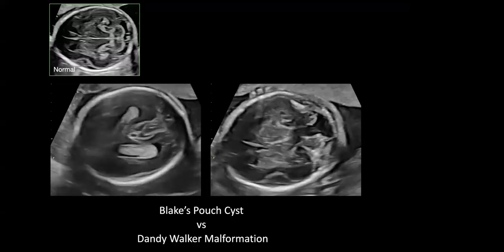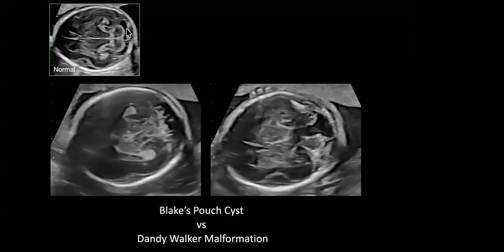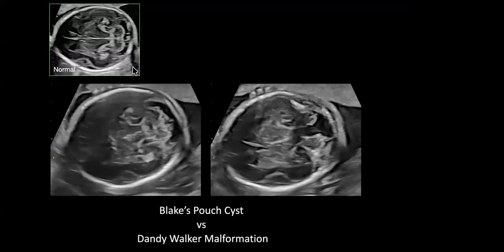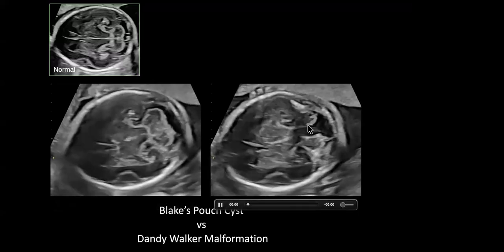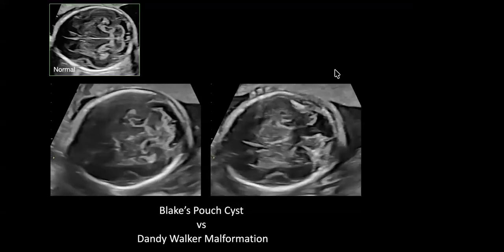Patient came in for an ultrasound scan. Sonographer was scanning. We know what a normal posterior fossa should look like. We know what a normal cerebellum looks like. This is something that we all obtain, especially in the standard imaging as well. As the sonographer was scanning, she saw what looks like a keyhole appearance within the fetal head. So it's abnormal.